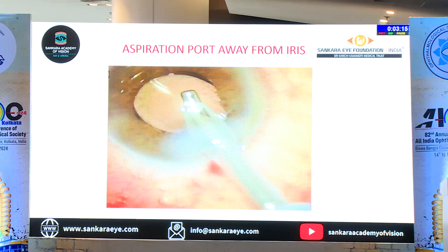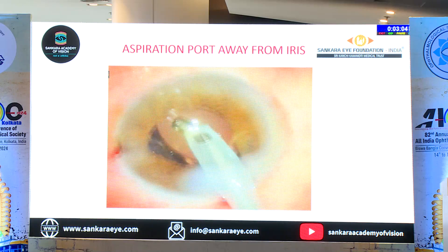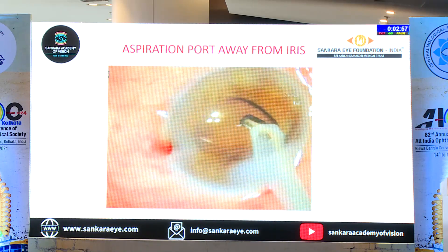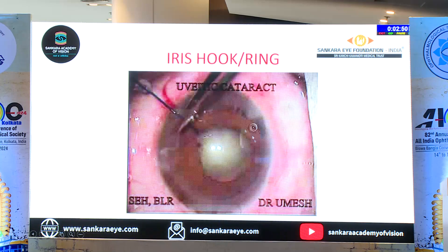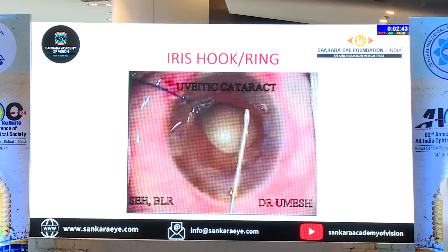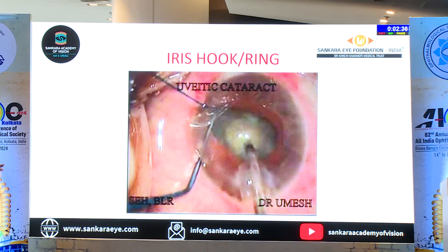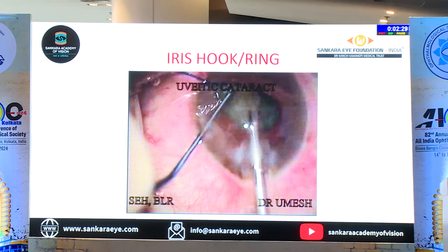Regarding the aspiration port: you just have to make sure that the aspiration port is always away from the site which you have touched. The other iris parts will never come to you — it is only those touched portions which keep coming. So all the aspiration you do with the aspiration port away. With that you can somehow manage. But in very severe cases you may have to use one or two hooks. Usually because the touch is on one side you can use a single hook, but if you have a very small pupil you can go for multiple hooks or a ring.